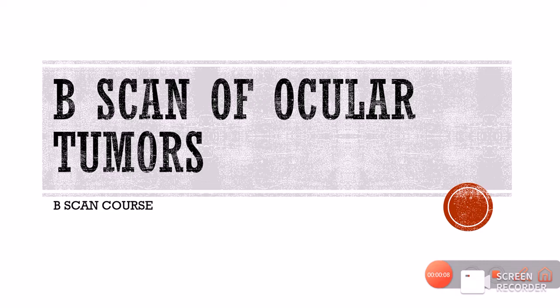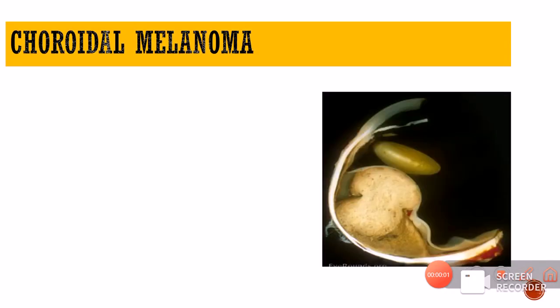Today we are studying how to do a Bscan of various ocular tumors. So without any delay, let's get started. Let us start first with the choroidal melanoma.